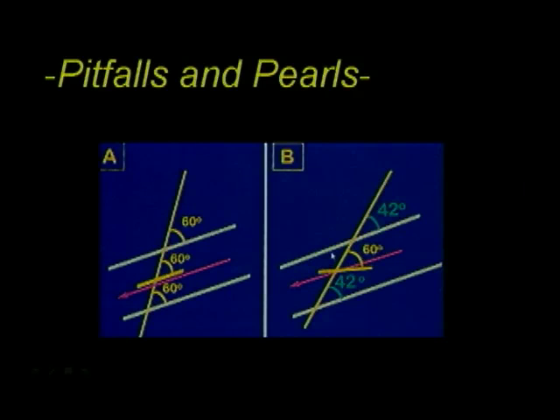I've seen this done in many labs where the mistake is to set the angle cursor to 60. However, the technologist or sonographer will often fail to make sure that the angle cursor is in fact parallel to the vessel wall. In this case, although the Doppler angle is corrected to 60 degrees, the beam angle in fact intersects the vessel wall at 42 degrees, and this will result in errors in the acquisition of blood flow velocities.